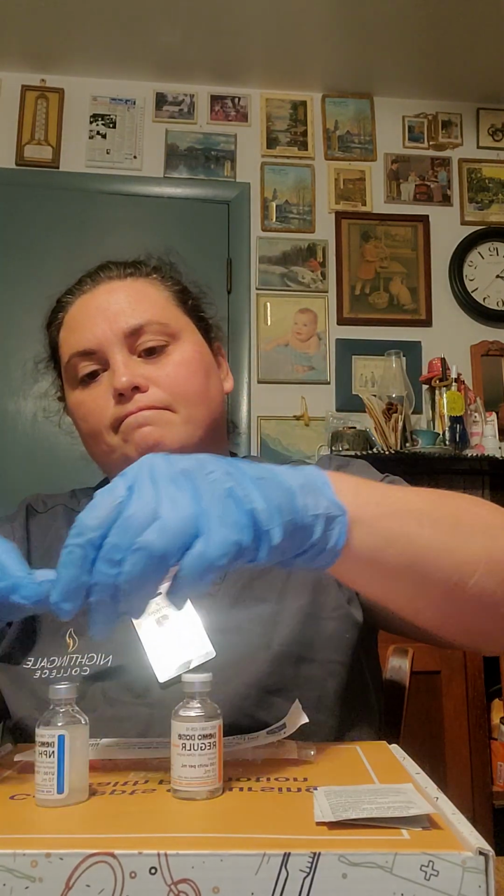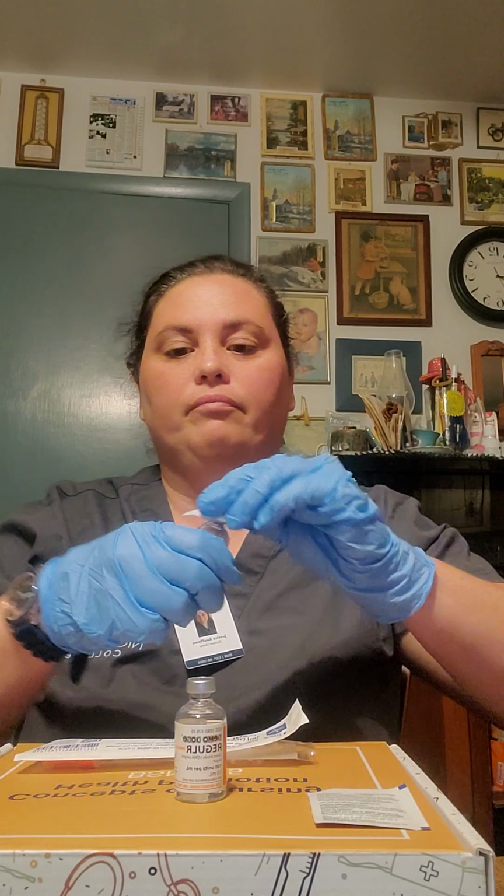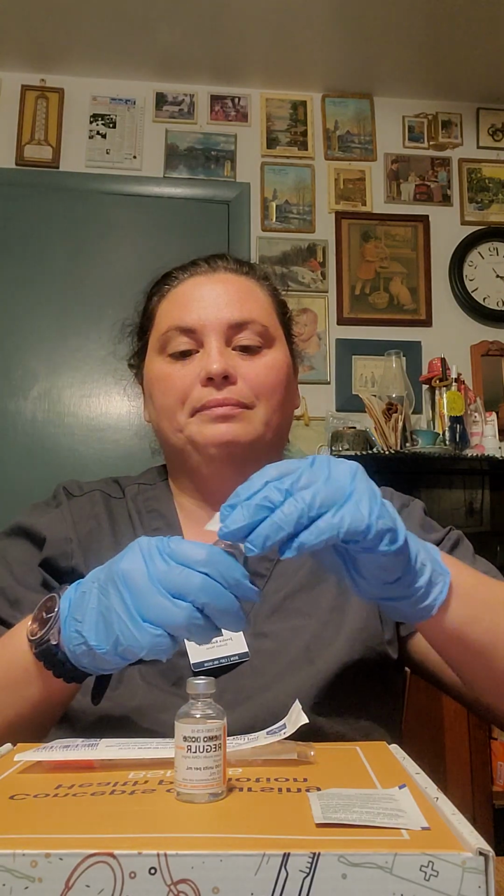Okay, so first, beginning, I am going to roll the vials. Okay, that one. Going to roll this one. Alright, I then would pop my tops. I'm going to clean with alcohol. Scrub the hub.